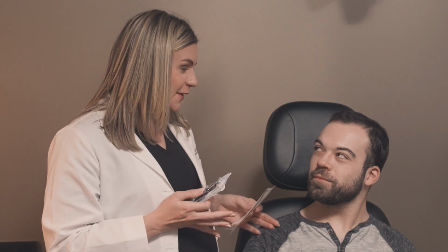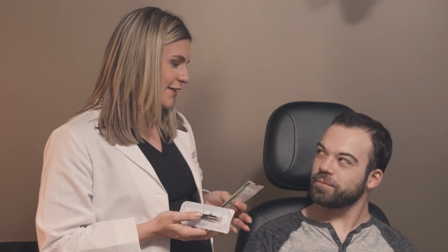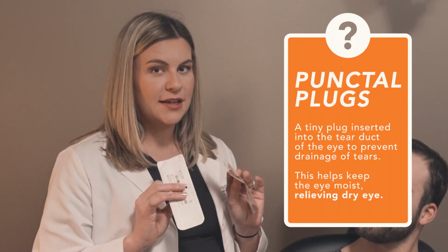So we're gonna be putting some punctal plugs in today. Dominic is gonna have LASIK surgery soon, and what's really important with LASIK is that your eyes are not dry at all before we do the procedure, and we wanna help him after as well to keep the tears on the eye. So one way we can do that is by using punctal plugs.